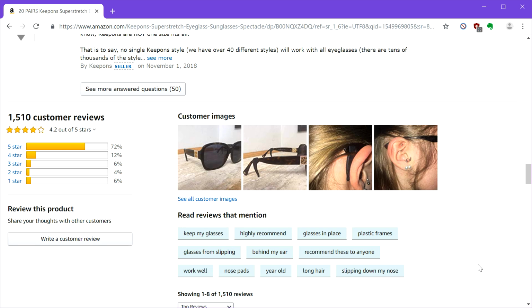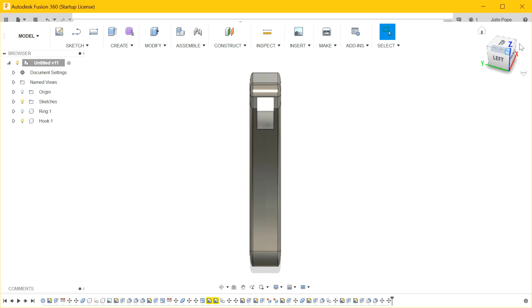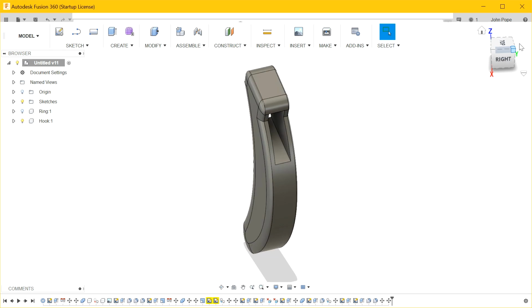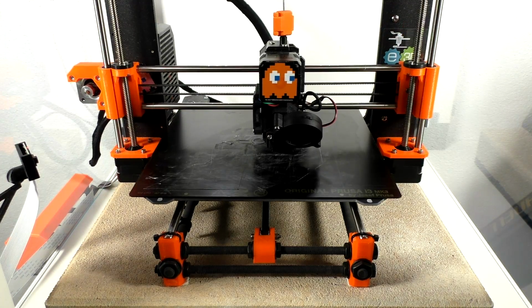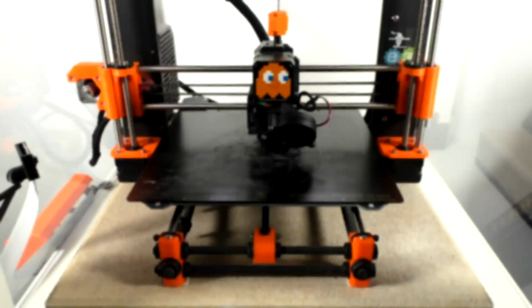Let's design something similar. You could print this with PLA, but it probably won't be comfortable to wear. Instead, I'll try it with something flexible, like TPU. Printing with flexibles can be difficult, so here are a few tips. Print very slowly, around 20 mm per second.